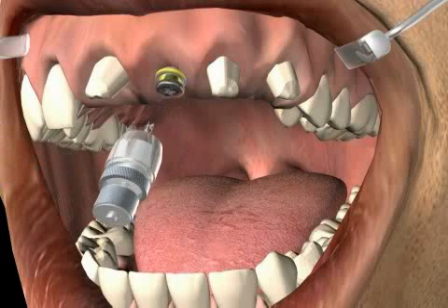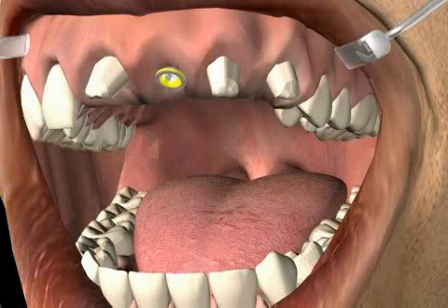The teeth were grinded down and a provisional solution was put in place for the aforementioned time frame. The provisional solution and the gingiva former have already been removed in order to be cleaned.